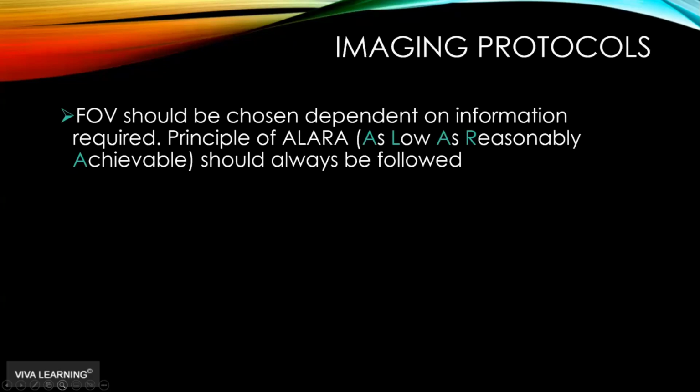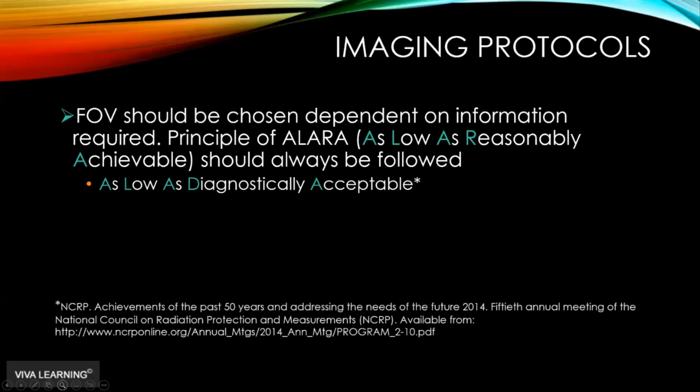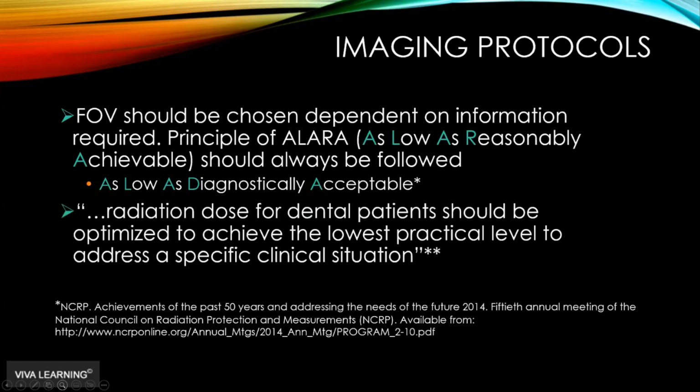As low as reasonably achievable should always be followed, the ALARA principle. But nowadays we're talking about the ALADA principle, as low as diagnostically acceptable. And this came from the NCRP, which goes back to the point that there's no point in reducing the amount of radiation down to a point where you're not getting the information that you require, because then you've just wasted the radiation. So we need it to be as low as diagnostically acceptable.